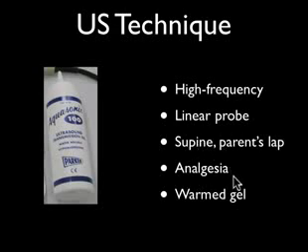But it's this part right here, warm gel. It's amazing how the cold gel in the kid can, it's like you're bringing a little squirrel over to eat a nut out of your hand, and all of a sudden you freak them out with the cold gel. So put some warm gel on there. We have a gel warmer that we keep a bottle set aside for kids with. It's actually in our heater for our warm blankets as well. So that's the way to go.